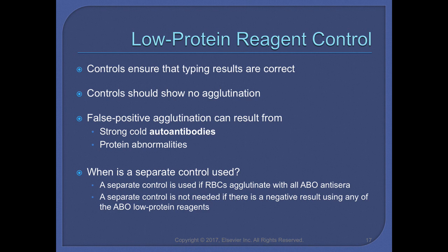Let me know if you have any questions about this, but I want to make sure that you understand when a control is included with your anti-D testing, and what it means when you have a positive and a negative reaction.